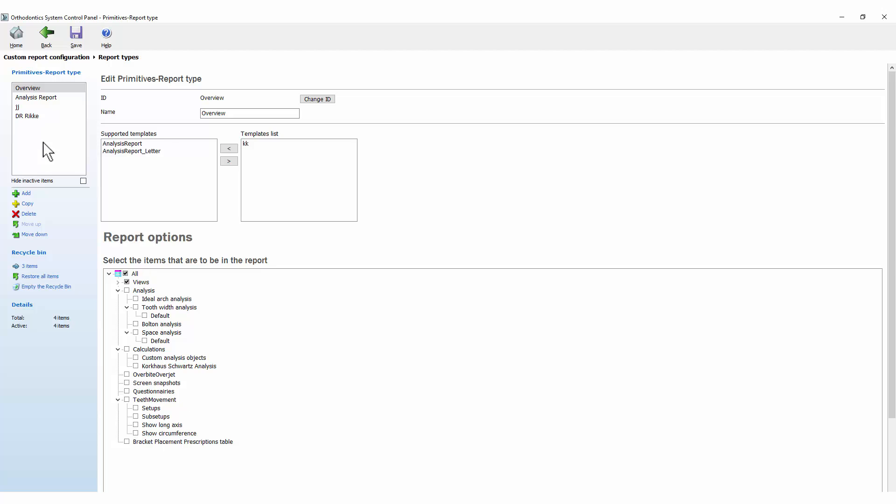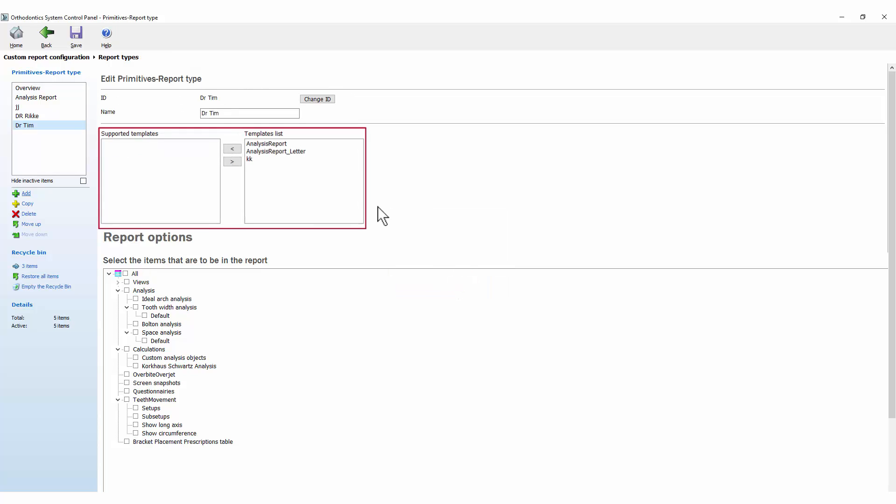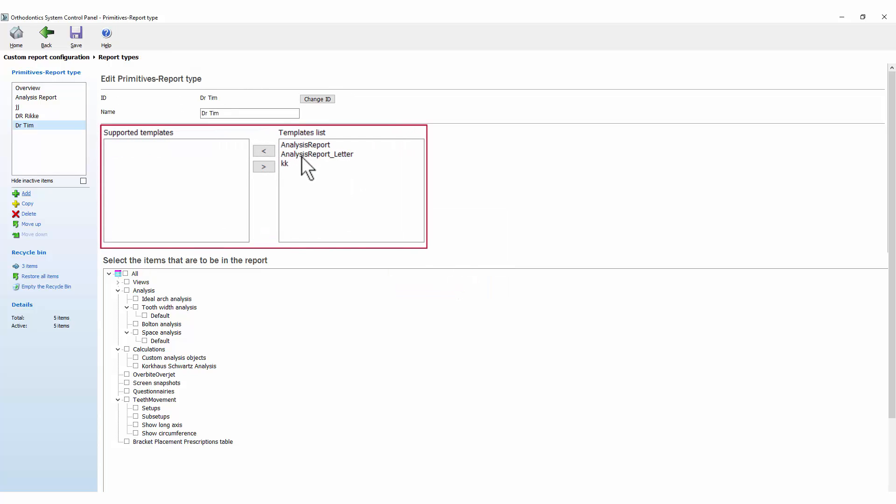To create a new report type, click the Add button, fill in the name of a report in the window that pops up, press OK, and choose which template you wish to use.